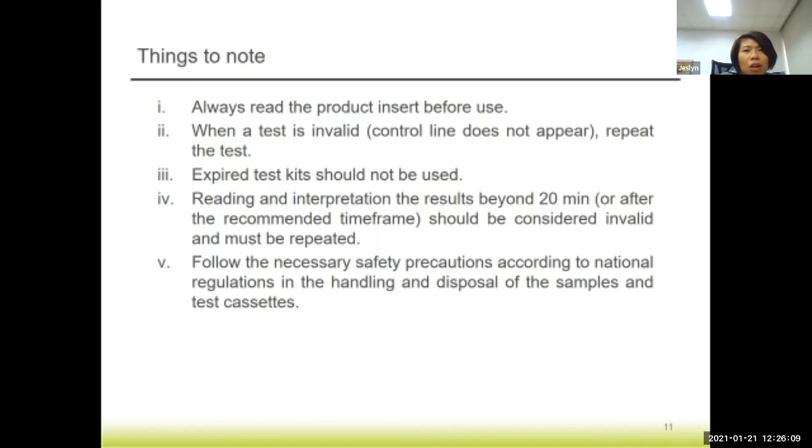Reading and interpretation of results beyond 20 minutes should be considered invalid and must be repeated. Some manufacturers advise that beyond 20 minutes the test line may turn positive even for a negative sample. So take note that results must be read at the right time, within the correct timeframe. It is also important to follow necessary safety precautions according to national regulations in your country for the handling of mosquito samples and the test cassette itself.